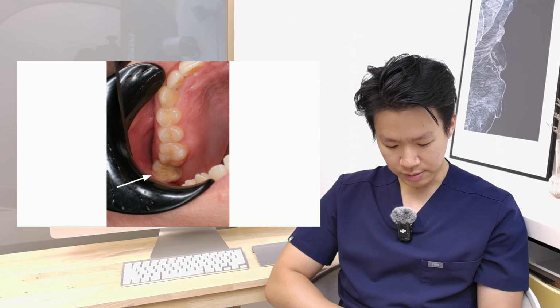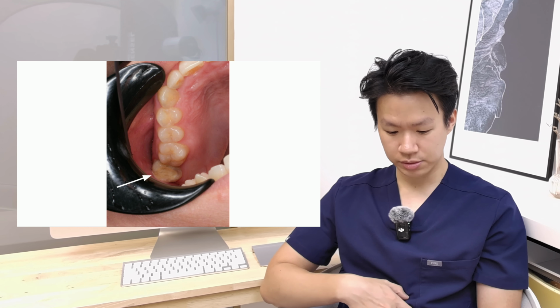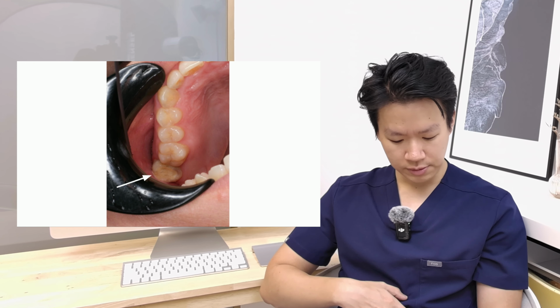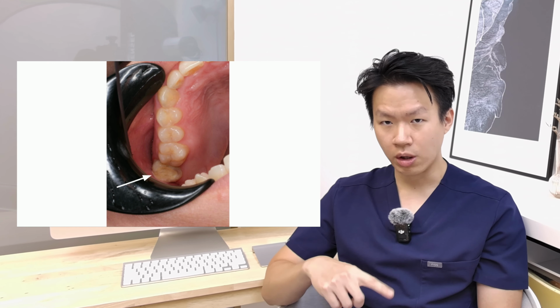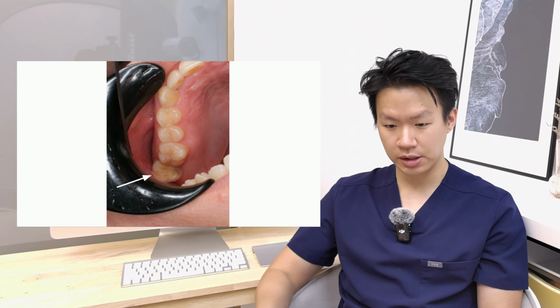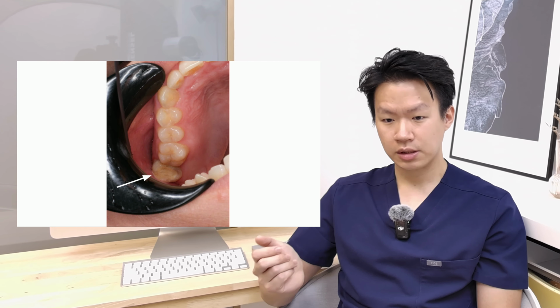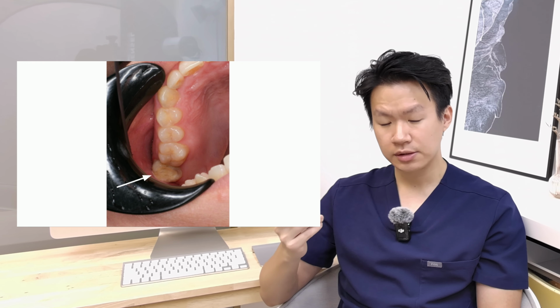For this particular patient, as you can see from the first photo we took, there isn't a lot of remaining tooth structure. The bulk of the tooth is essentially just filling material with just a thin wall of sound tooth structure remaining. Another thing we have to consider is that this tooth appears very short, so there isn't enough tooth height.